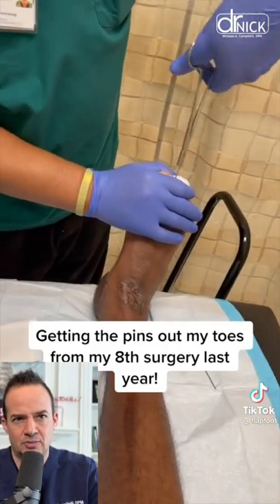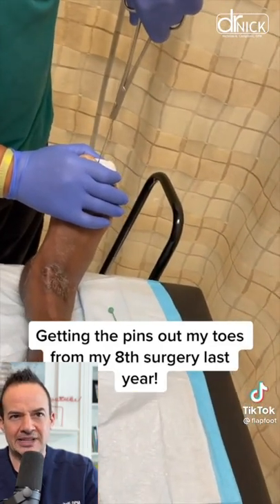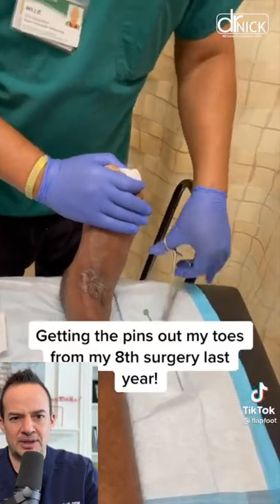Then you start to pull, and you can see it's coming right out. This actually isn't that painful, and there's no bleeding — sometimes just a little bit of blood in that pinhole.